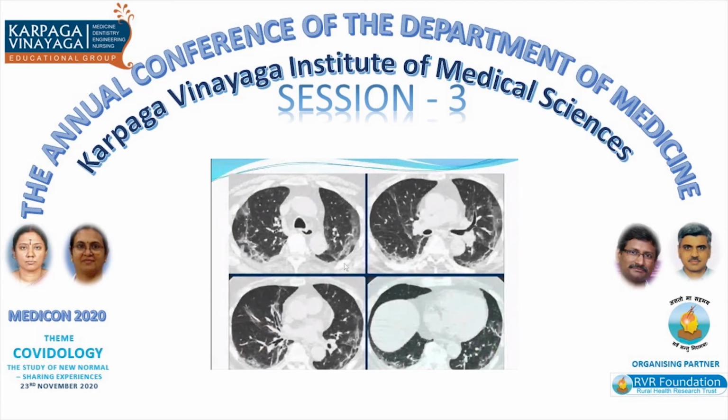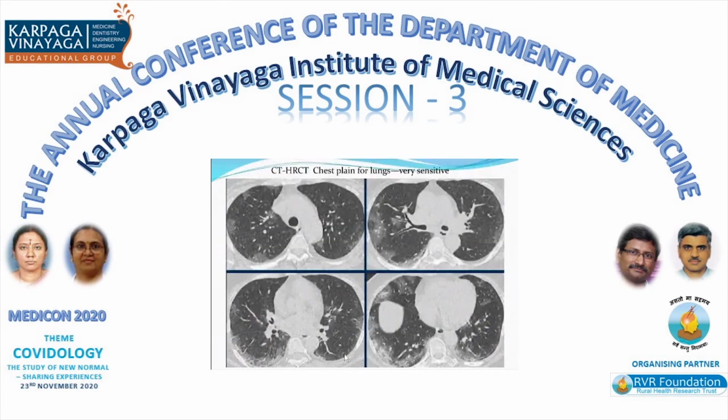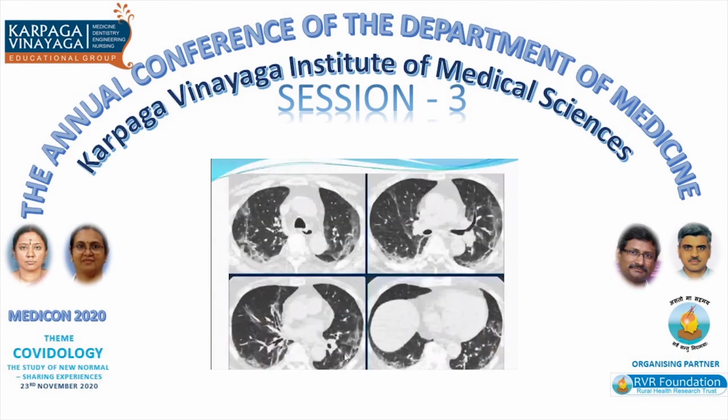Then there are certain other areas where the disease is more advanced. When you go into the subacute stage, that is 5 to 10 days, these areas get more mature and you get these subpleural bands. So this is a kind of mature COVID. This is early COVID, very early in the first 1 to 5 days, and this is a slightly mature COVID.